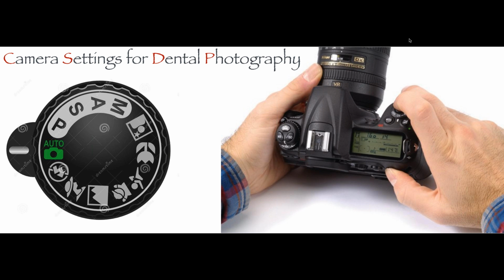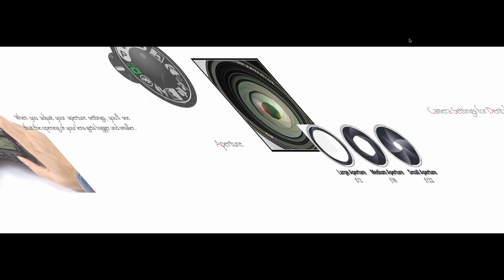So what are the camera settings that we're going to be using? This is the important portion of the lecture, because this is what you should know so that you do not make the beginner's mistake of trying to use your camera in an automatic setting or priority setting that will make all the decisions for you. You have to decide what kind of ISO you want to use, what kind of f-stop you need to use, what kind of shutter speed you need to use. You are going to select that. And it's a very simple way to do it.